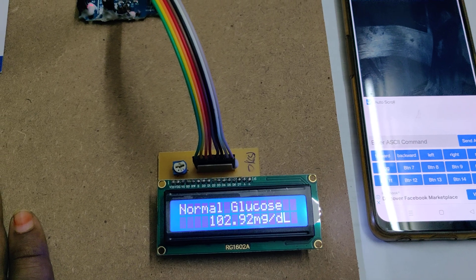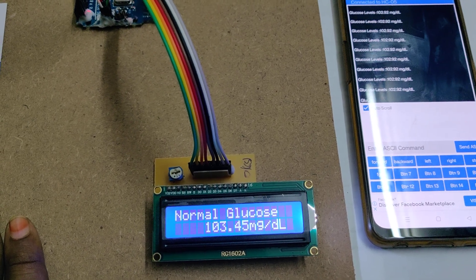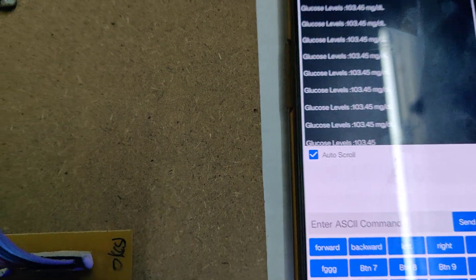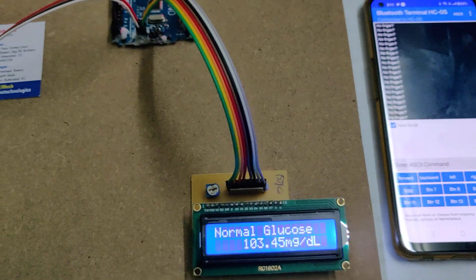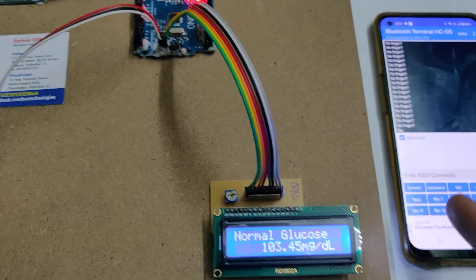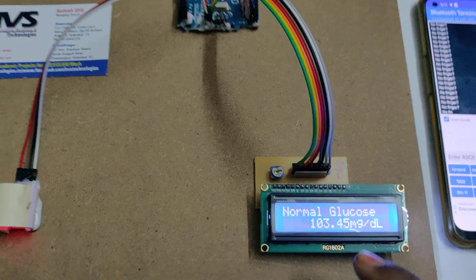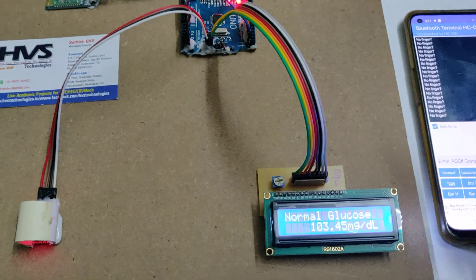If you move the finger then the fluctuation will be more; if you keep it still normally, it will stabilize — as you can see, values like 101 or 103. These are the glucose levels continuously monitored via Bluetooth, and this is the approximate value in mg per deciliter.